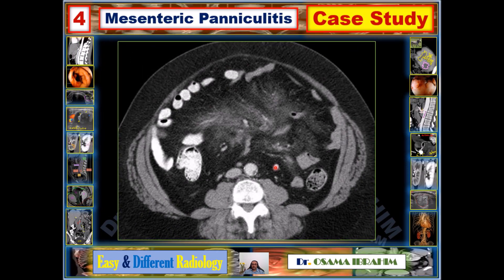In a CT abdomen with axial images showing fat stranding in the mesentery, this represents mesenteric paniculitis. You can notice the hyperattenuation of fat in the pathological regions, as well as a hypoattenuating halo sign surrounding it, which helps distinguish it from other mesenteric masses like lymphoma or mesothelioma. Mesenteric paniculitis is characterized by this halo sign and hyperattenuating fat inside.